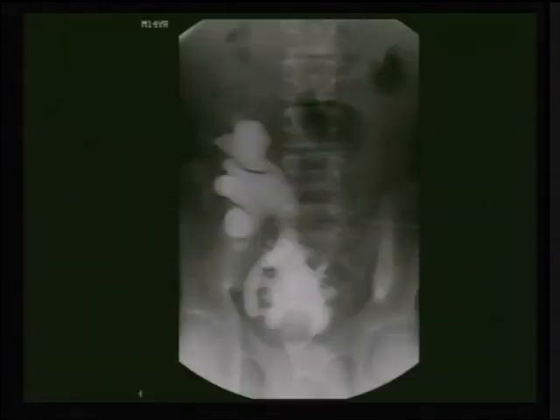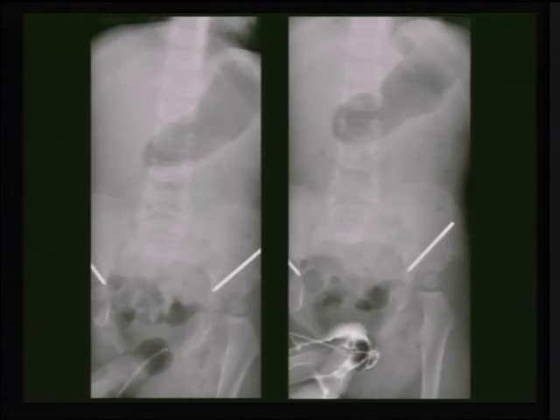What wrong techniques may we use? Neurogenic bladder: don't use a Foley's catheter. We said that we almost always use a feeding tube, but we may use a Foley's catheter only in special cases, like ectopia vesica, if there is a normal bladder but continuous leakage due to a patulous internal sphincter. But in a neurogenic bladder, you want to know the capacity. If you use the balloon, you are not going to know the capacity well, and you may increase the pressure beyond an acceptable limit. And this is a wrong technique.